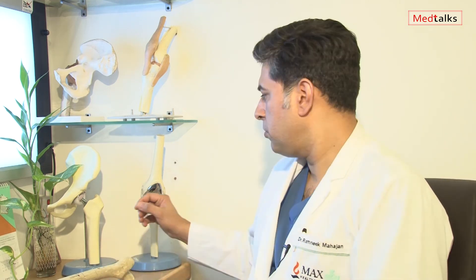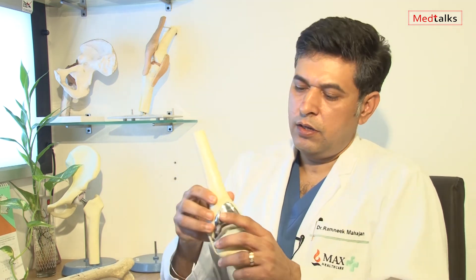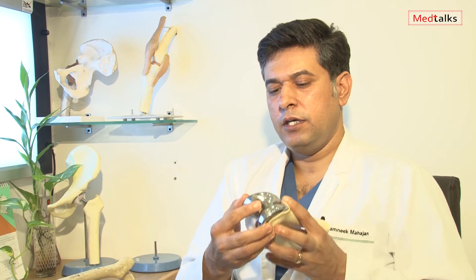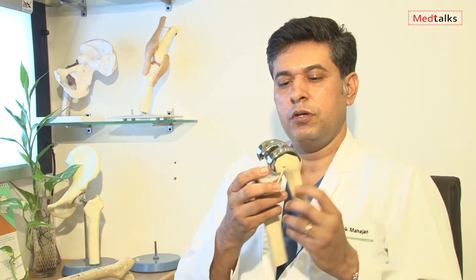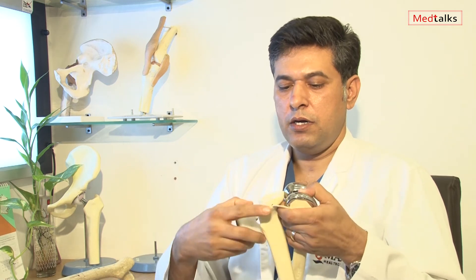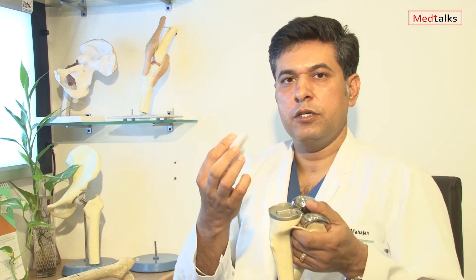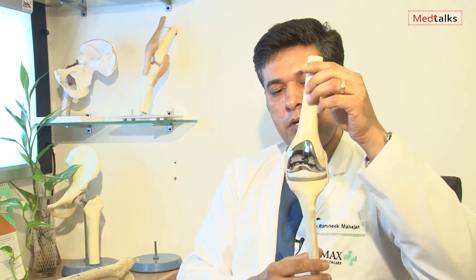This is what a total knee replacement looks like, wherein the femur, which was covered with cartilage, now has the femoral component put on top. The tibia is made smooth, the tibial component is placed in between, and on the tibial component this polyethylene is placed — this becomes the total component, looking like a total knee replacement.